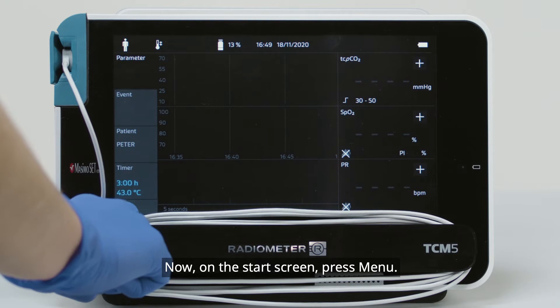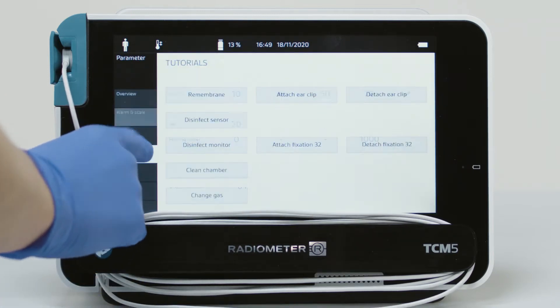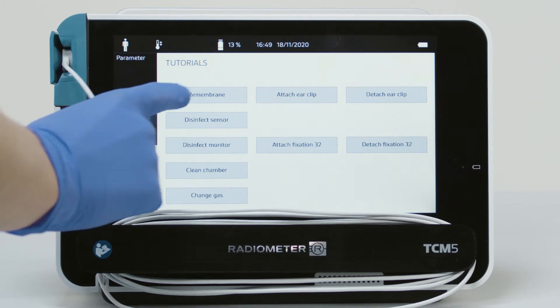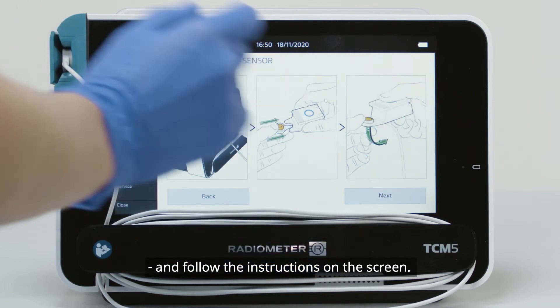On the start screen, press Menu, then Tutorial, then Re-membrane. Press the Start button and follow the instructions on the screen.